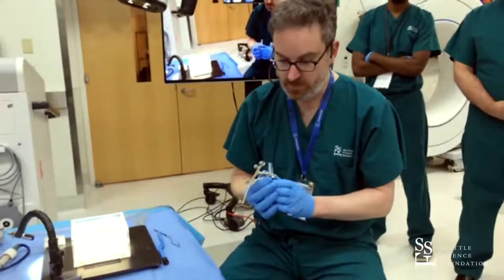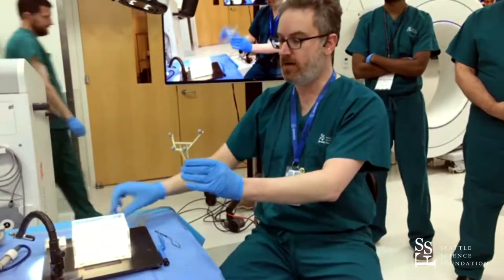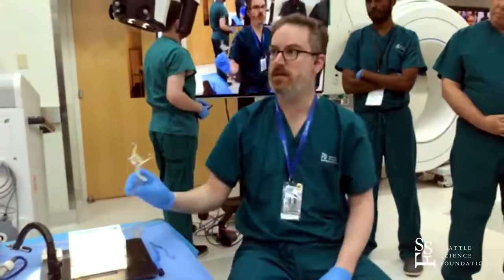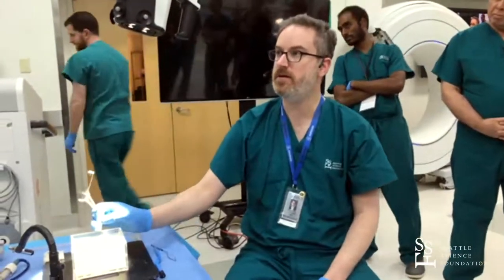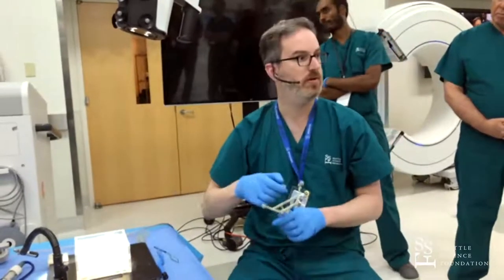One of the things I like about this system is that when the trocar comes out, you're still tracking and navigating your port. You get real-time feedback, and you can see in the picture-in-picture up here you get real-time feedback of where you are, even without a pointer in there.